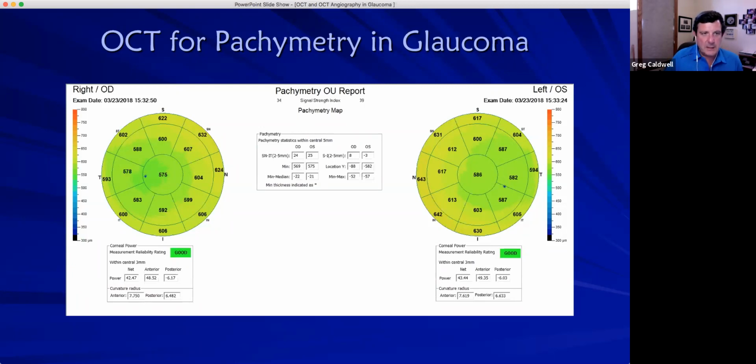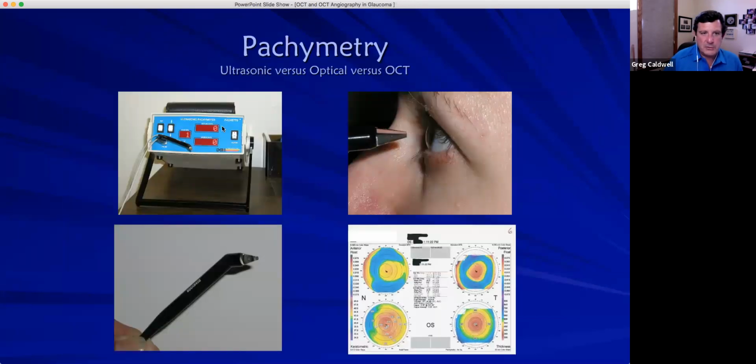So I do like using OCT pachymetry. It's just more accurate over ultrasound. And it was actually Dr. Salka who you and I think your wife Jo did a small study using ultrasound and pachymetry, finding that the OCT was going to be a little bit thinner because it's always hard to get perpendicular on that cornea. Is that how that all kind of shook out?